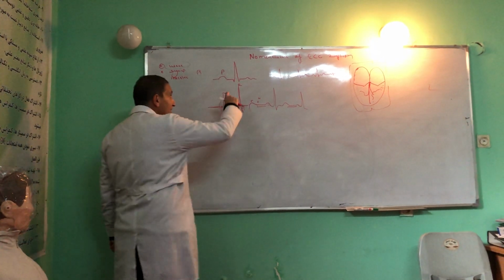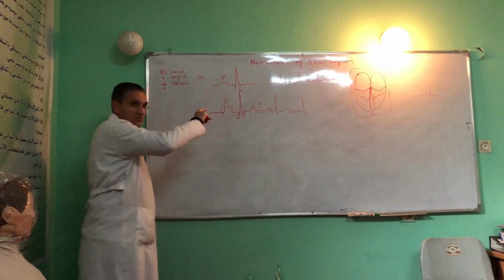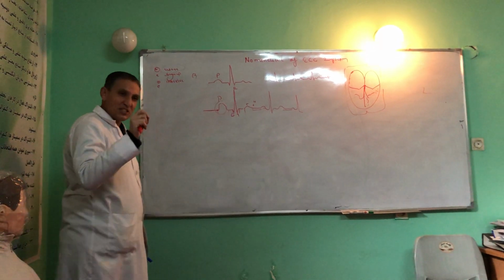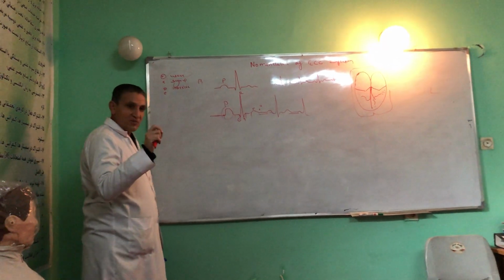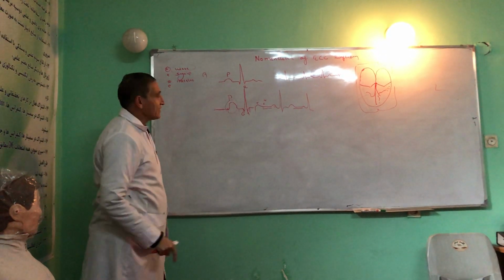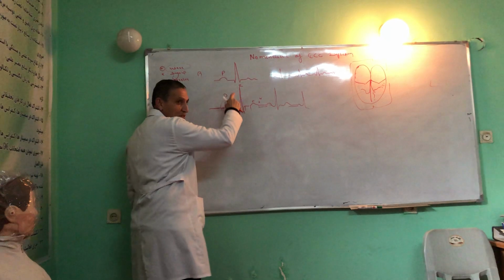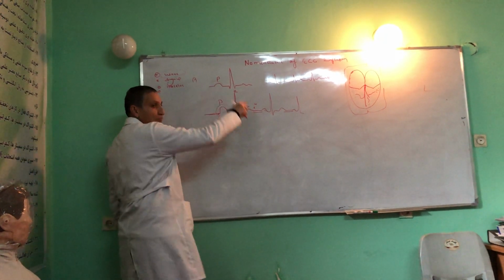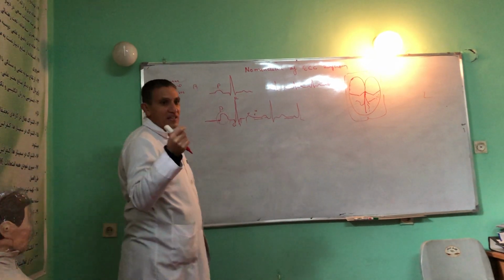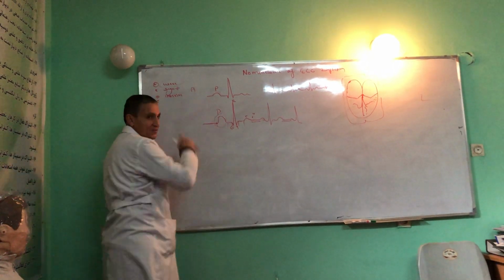The reason is because of two things. One is slow repolarization of the atrium. Another is that the atrial tissue is a small tissue, so the repolarization wave is a small wave. Therefore, when the ventricle is electrically activated, this activation captures the repolarization. So from atrial depolarization we get just a single wave, which is called the P wave.